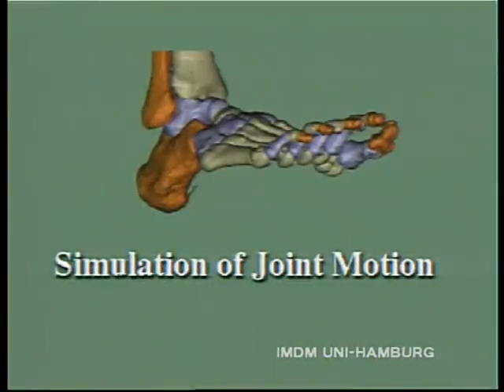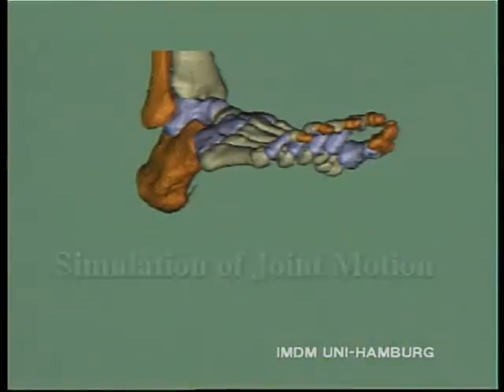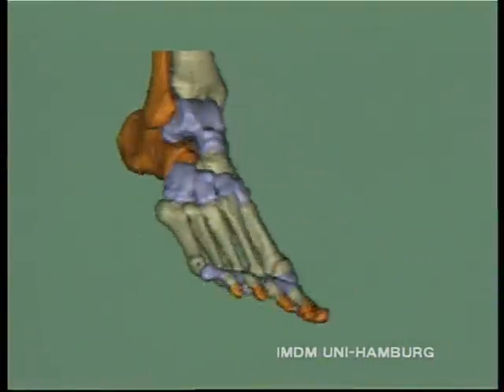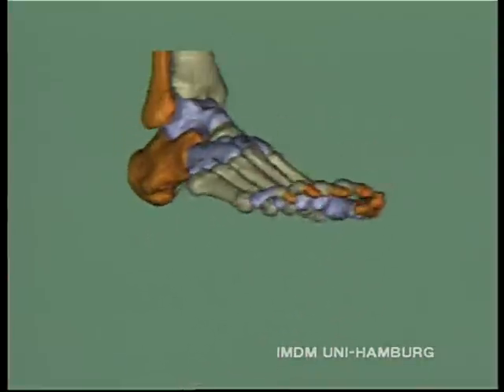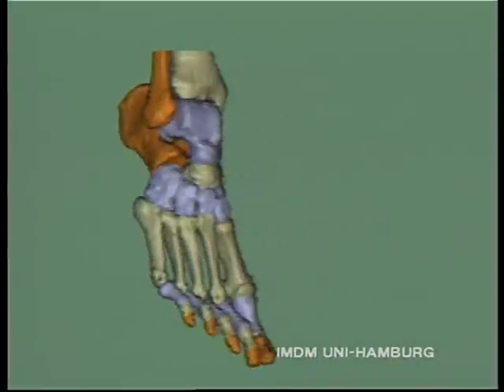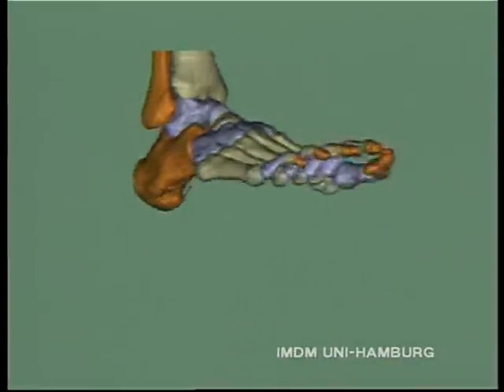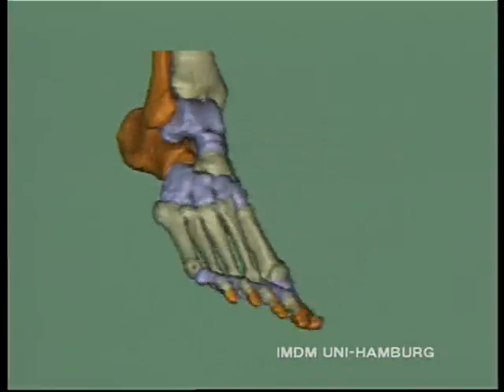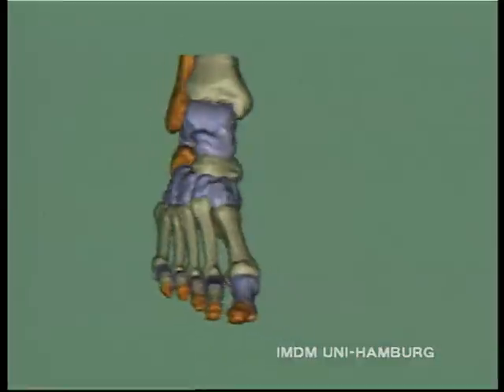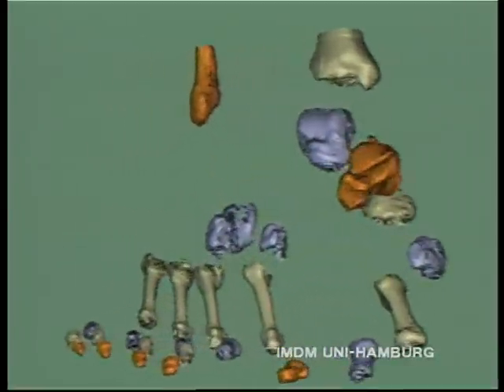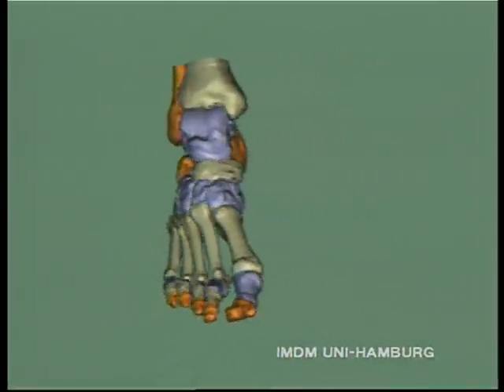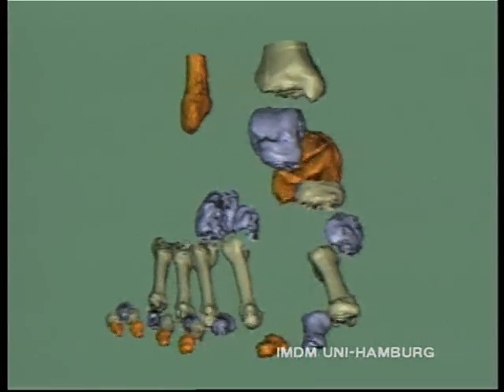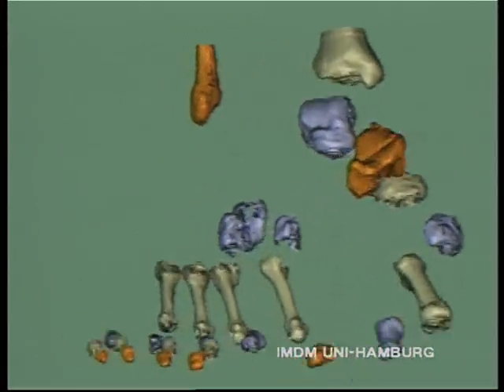Even motion such as that of joints can be simulated. This example shows the motion of an ankle joint. A blow up may illustrate shape and the relation of different anatomic structures.